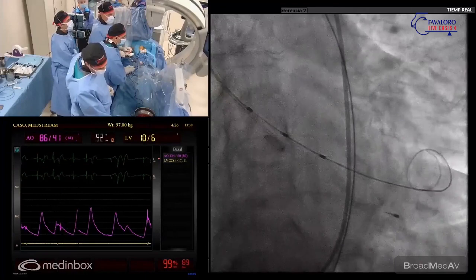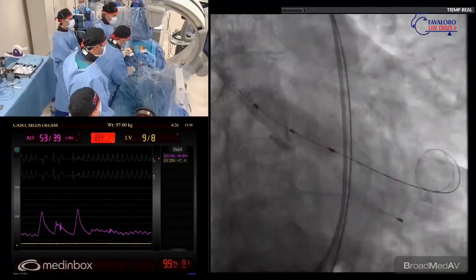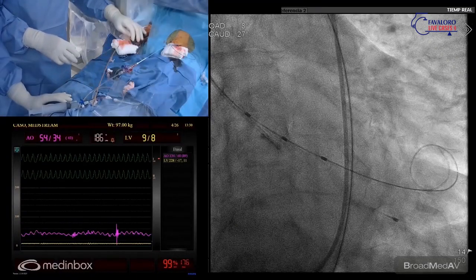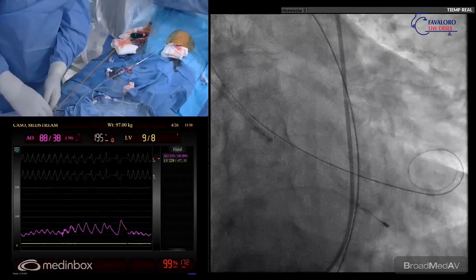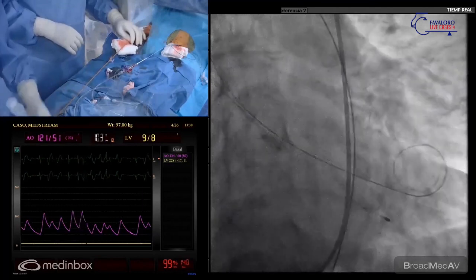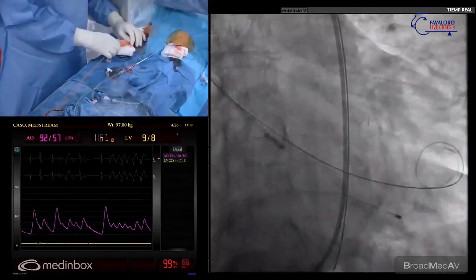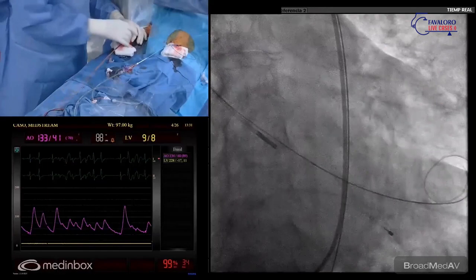So this is an 18 balloon. Inflation. Mammoth balloon. So we are pacing the patient. Okay. Stop pacing. Stop. Cut the pacing. Cut it completely. Good. Yes, perfect. So good shape of the pressure and of the balloon. Don't let the wire come back. Leave it well. So Juan is going to bring the valve. Carlos is trying to leave the wire as distal as he can, to have enough space for the nose cone.